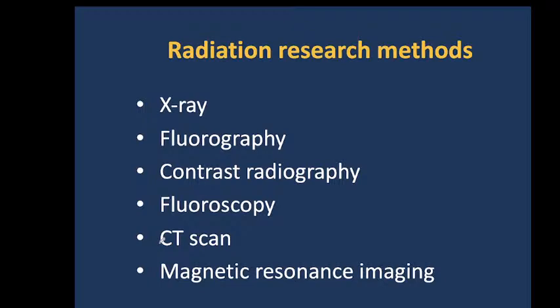In our country the more usable term is Röntgen diagnosis; X-ray is the term for Western universities. The most commonly used method is of course X-ray examination, also called Röntgen examination.